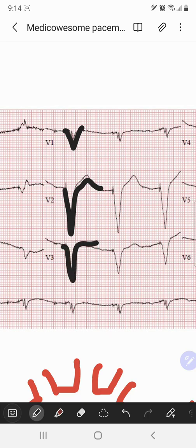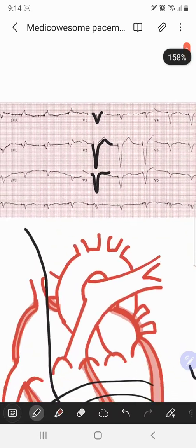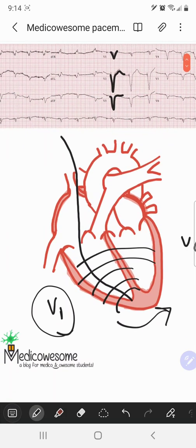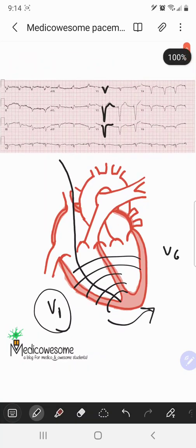In V2 and V3, you sometimes also see a broad R wave in leads I, V5 and V6, but in this particular EKG you can't see that. This is how a standard RV lead-based EKG looks.